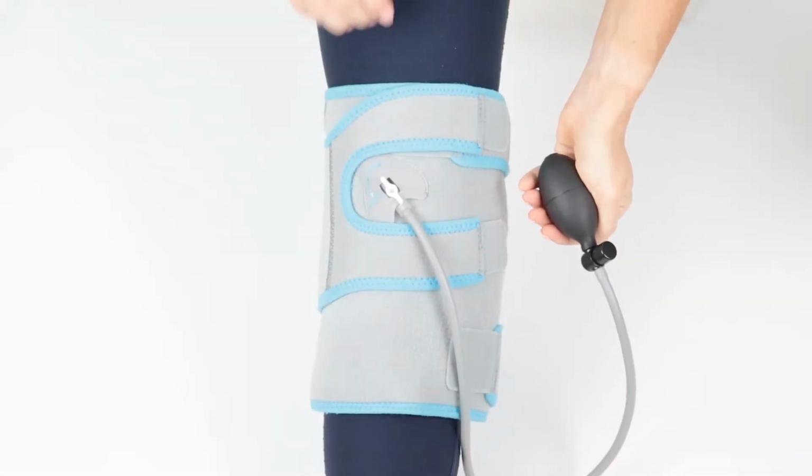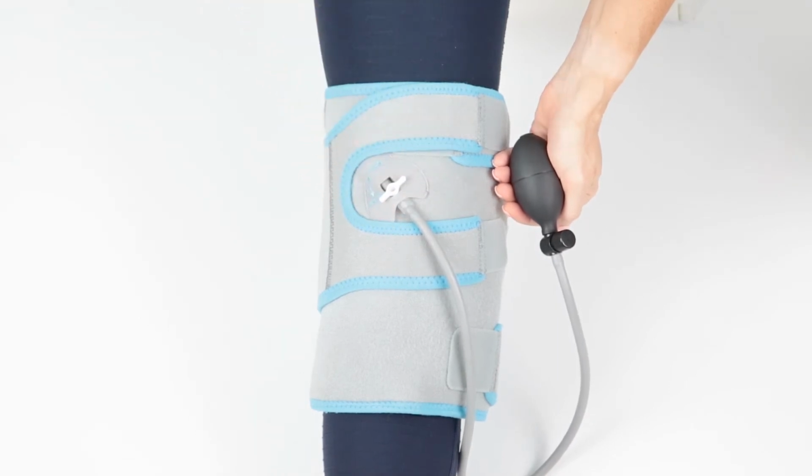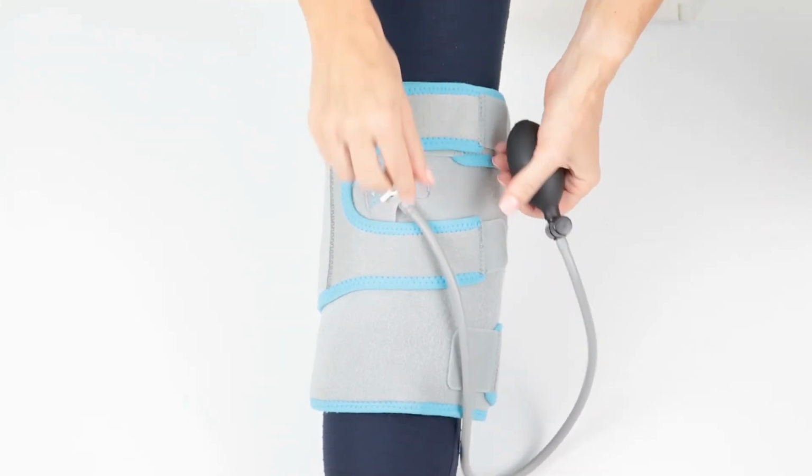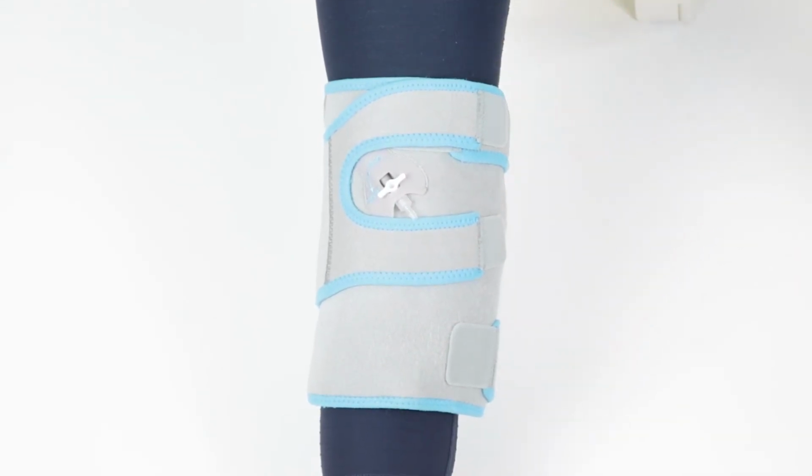When the desired compression is reached, turn the air valve to close to lock in the desired compression level and prevent any air leakage during treatment. You can then disconnect the air hose from the valve if desired.